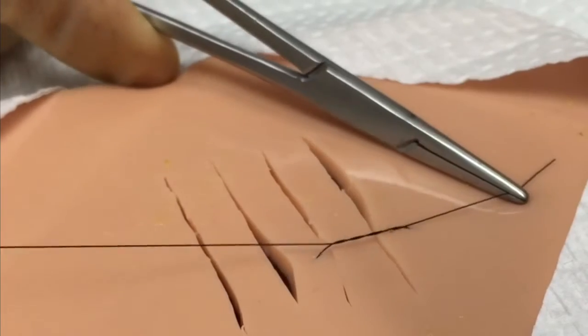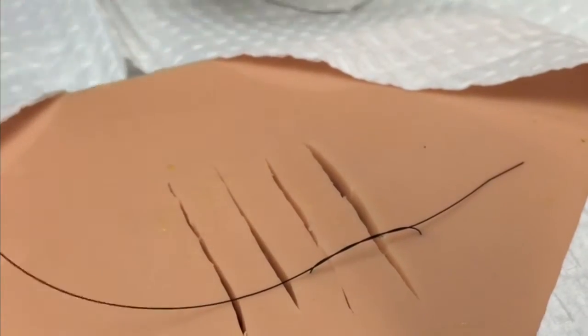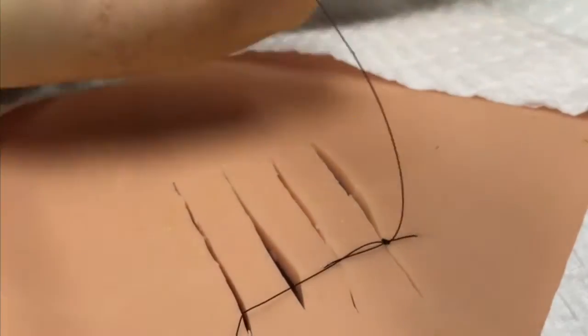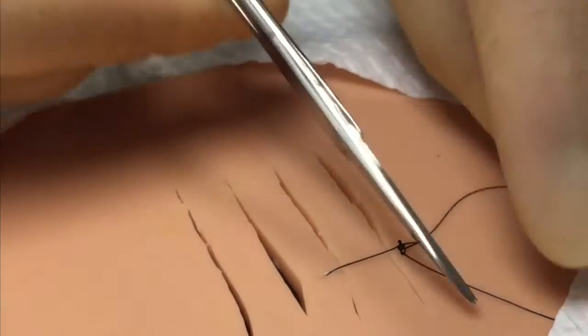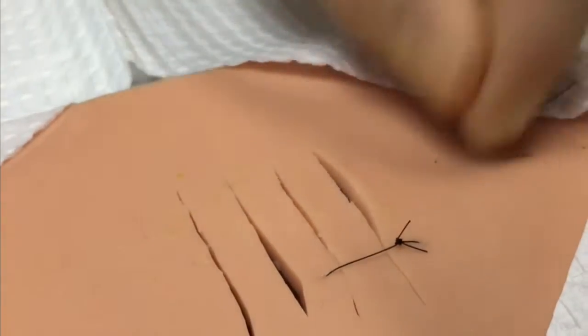The disadvantages of using this technique is that you lose control over the ability to precisely evert and approximate the edges of each individual laceration. Secondly, you end up bunching up the tissue that's in between the two parallel lacerations. A final drawback is that this technique can only really be used for two parallel lacerations and no more.